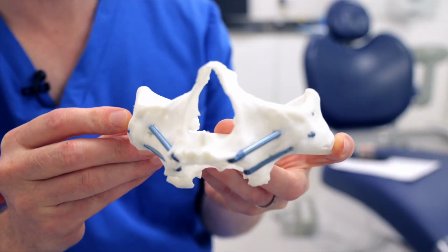So what that involves is placing longer implants but into the cheekbones, into the bone up here, and using that to support some teeth on it. So zygomatic implants are useful for people who don't have bone in the first place or have previously had attempts at implants, they've failed and now they're left in a situation where they don't have enough bone, or people who've had bone grafts which have not worked and similarly they need another way to restore their teeth. And the last section of people that it's useful for are people who want a quick solution, people who are not interested in long grafting procedures and wait times, who just want to get to fixed teeth as quickly as they can.